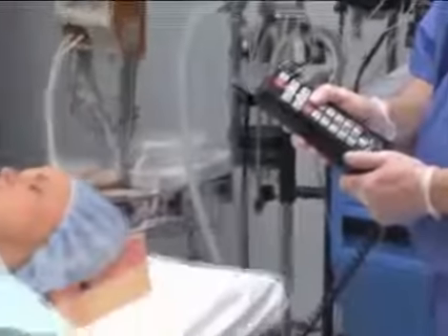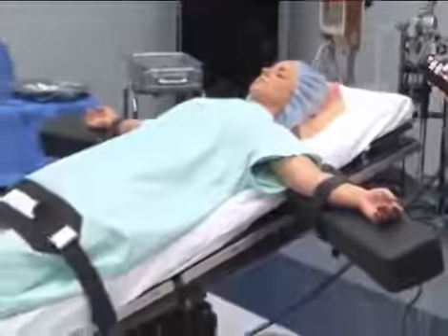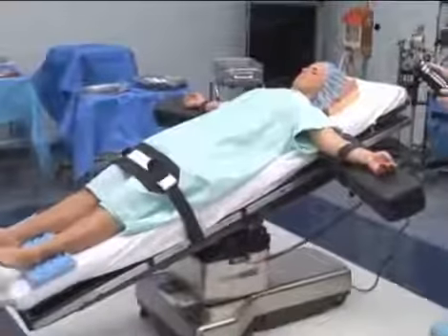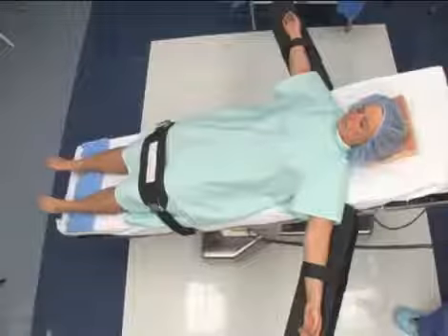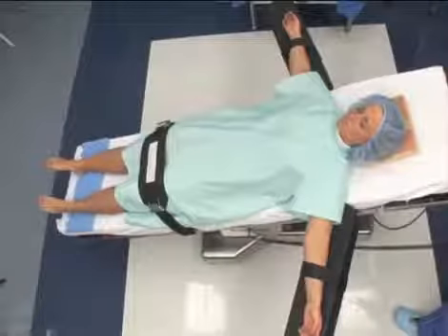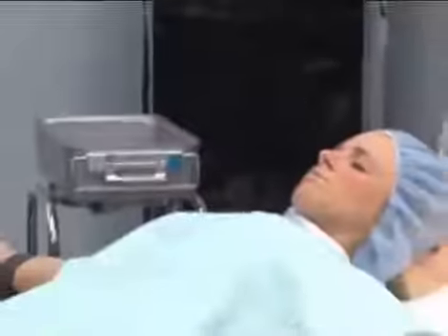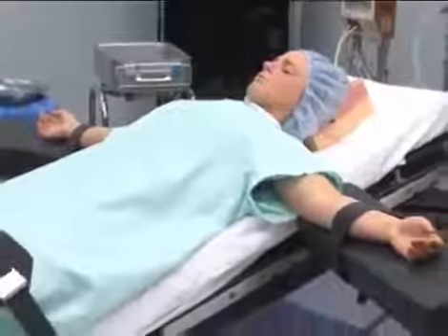The reverse Trendelenburg position, also a modification of the supine position, or foot-down position, is used when the surgeon requires unobstructed access to the upper peritoneal cavity and lower esophagus. When the operating table is tilted toward the patient's feet, gravity drops the viscera into the lower cavity, which allows a clear view of the diaphragm, cardiac sphincter, and esophagus.